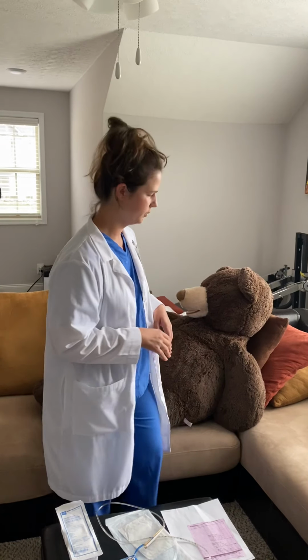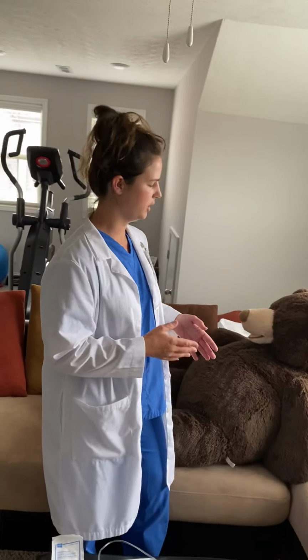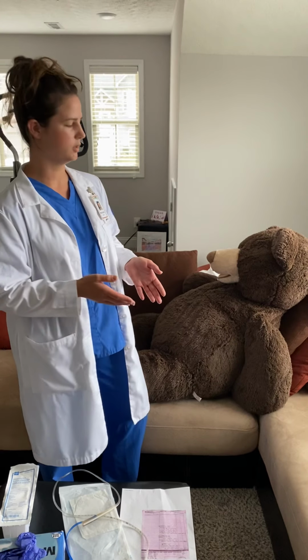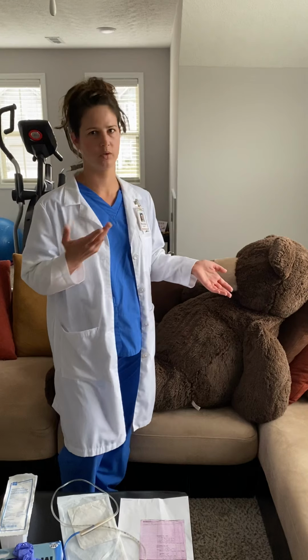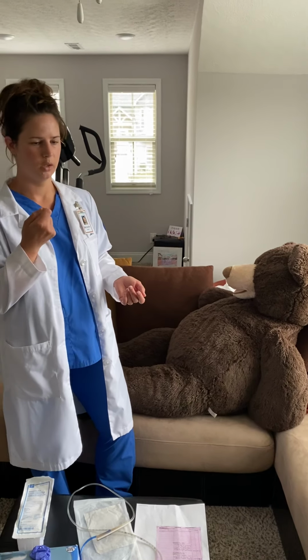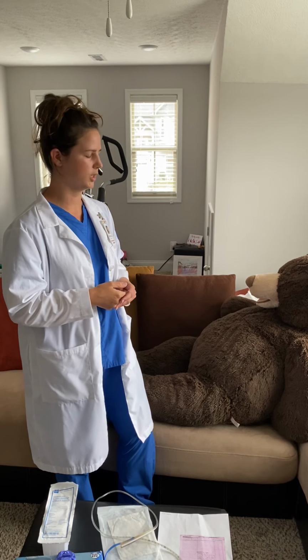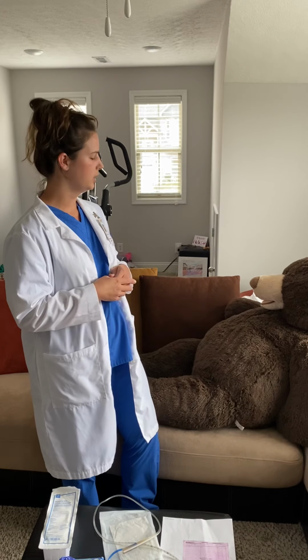All right, so we're first going to be talking about inserting the NG tube. You first want to make sure that you're assessing the patient. You want to do a focused abdominal assessment. You also want to ask them about any previous history of nasal surgeries or deviated septum. Upon assessment, you want to look up their nares for any blockage. Of course, if they did have surgery on one nostril or the other, you don't want to go up that nostril. Use the other one.